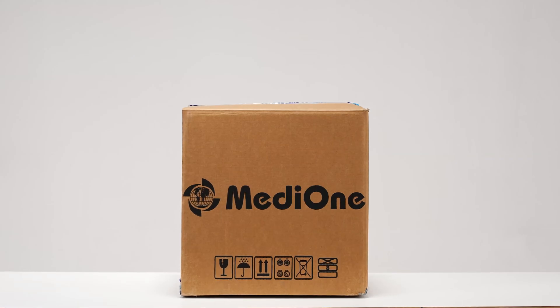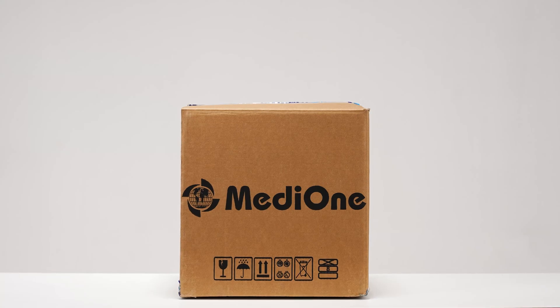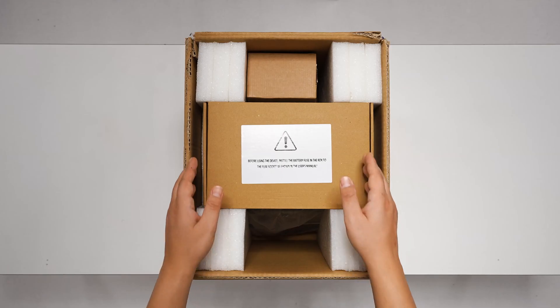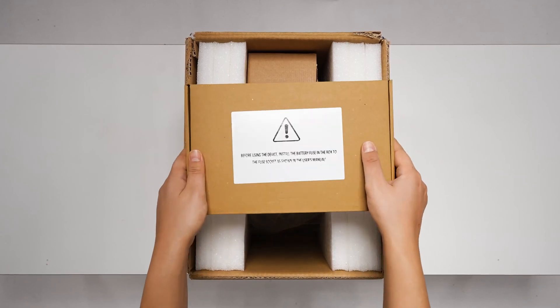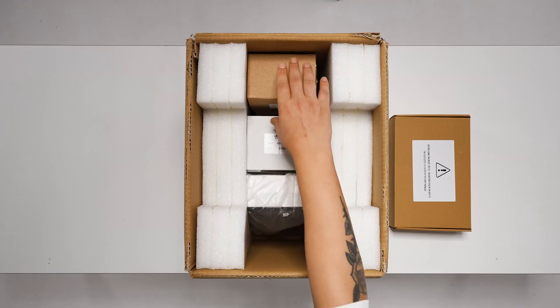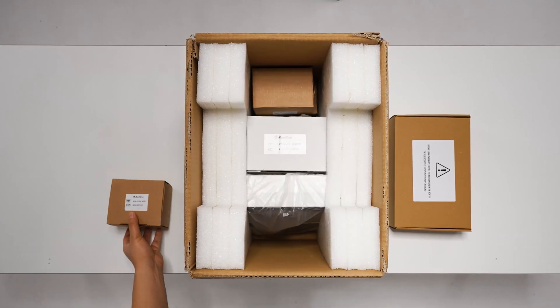This is how the product looks when it reaches you. Now let's take a look at the contents of the box. When the device reaches you, there are five boxes in it. One of them contains auxiliary equipment, and the other four boxes contain the cuffs.